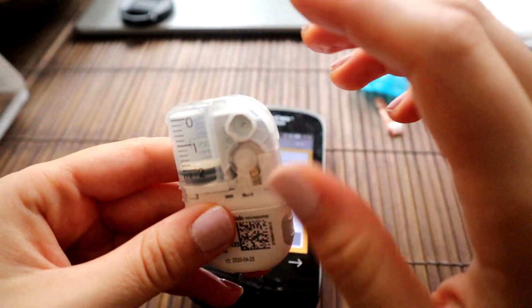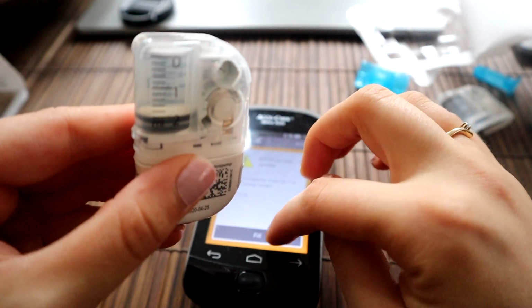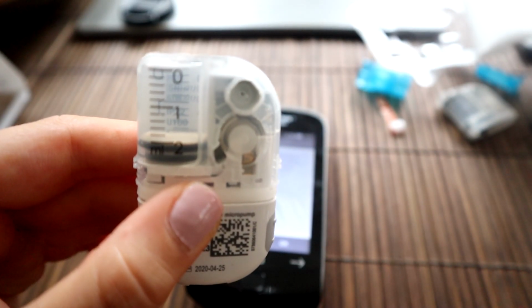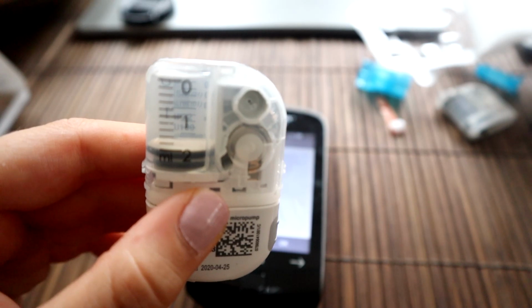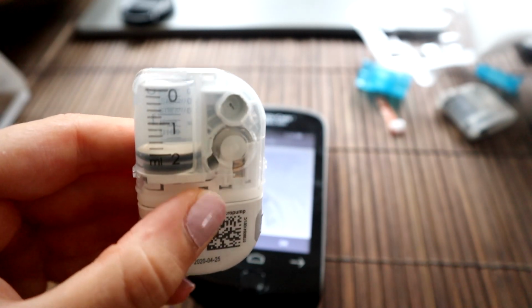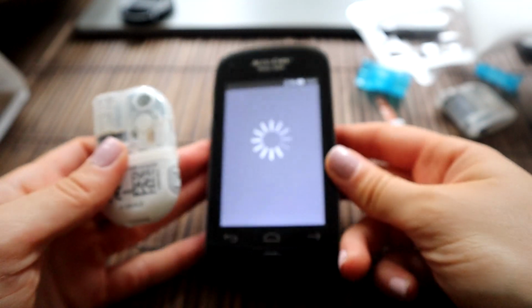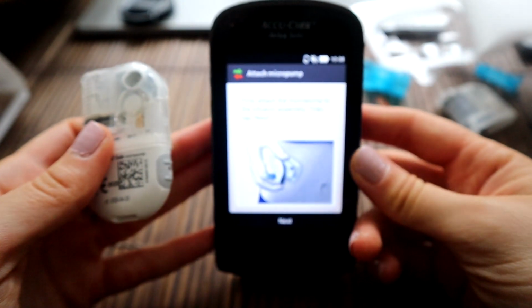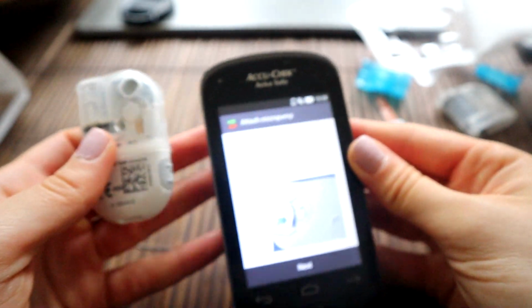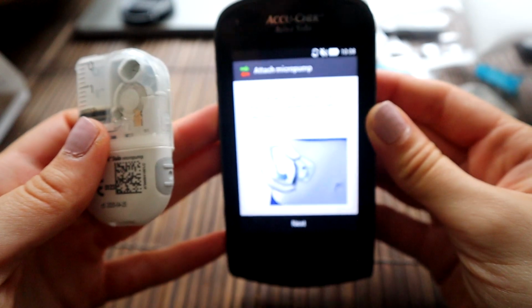So we shall press fill and start watching. Okay, I can't get it to focus properly, but I hope you can see there's a small drop of insulin on the end now. So we know it's all working, and we can press OK on here. And then it will just tell us to put the pump into the pump holder on the body. So let's do that now.